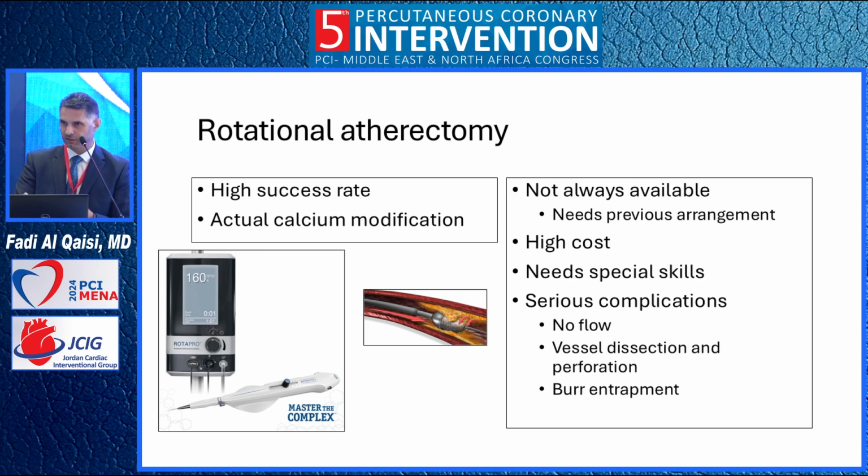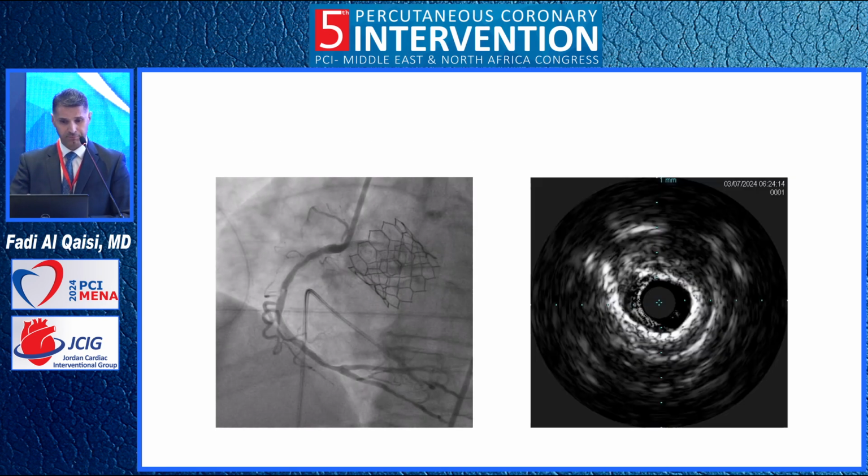And you have to have predictability that you are going to use the rotablation. High cost. You are talking about thousands of JDs when you are talking about rotablation. It needs special skills. It has special training, special pros and cons, and do's and don'ts for the rotational atherectomies. And it can lead to serious complications of no flow, dissection, perforation, burr entrapment.